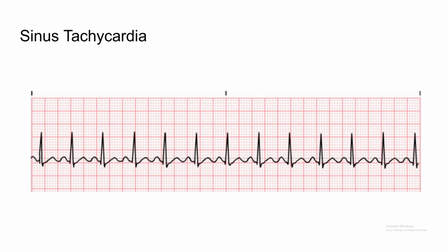There are a lot of causes of sinus tachycardia in general, but typically sinus tachycardia isn't the main issue when you see sinus tachycardia on the monitor. It's a symptom of something else. It's simple as that.